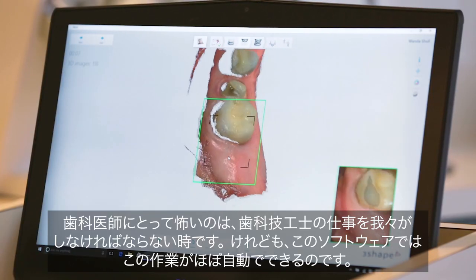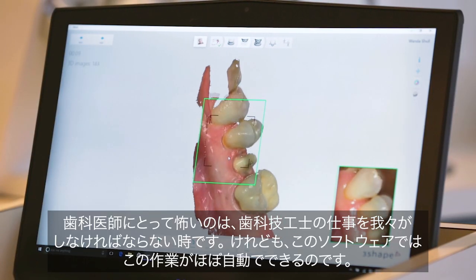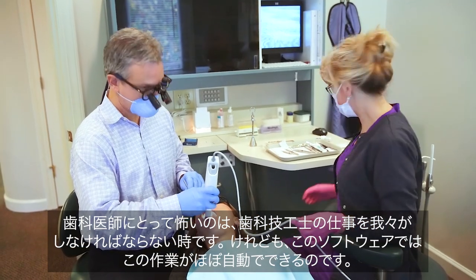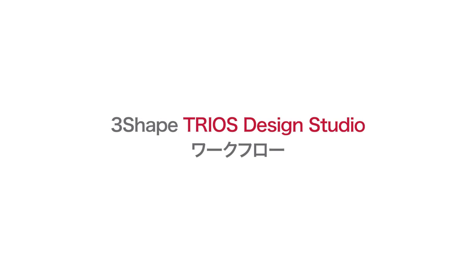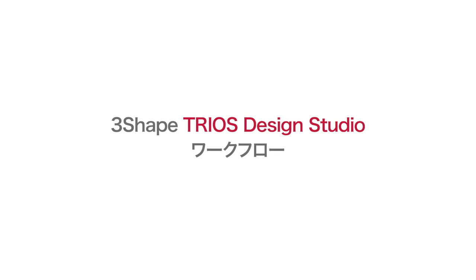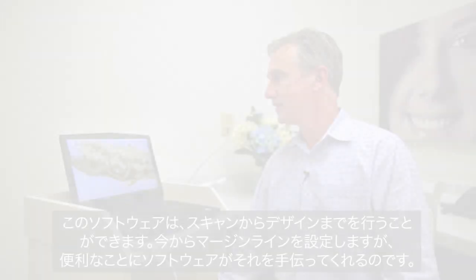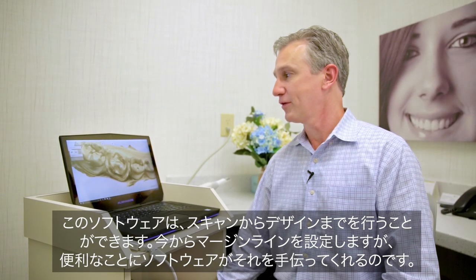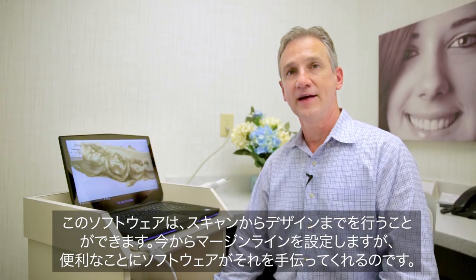Our fear in dentistry is that we have to become a lab technician, but with this software you can see that it's almost automatic. This software plays perfectly from scanning to now designing.